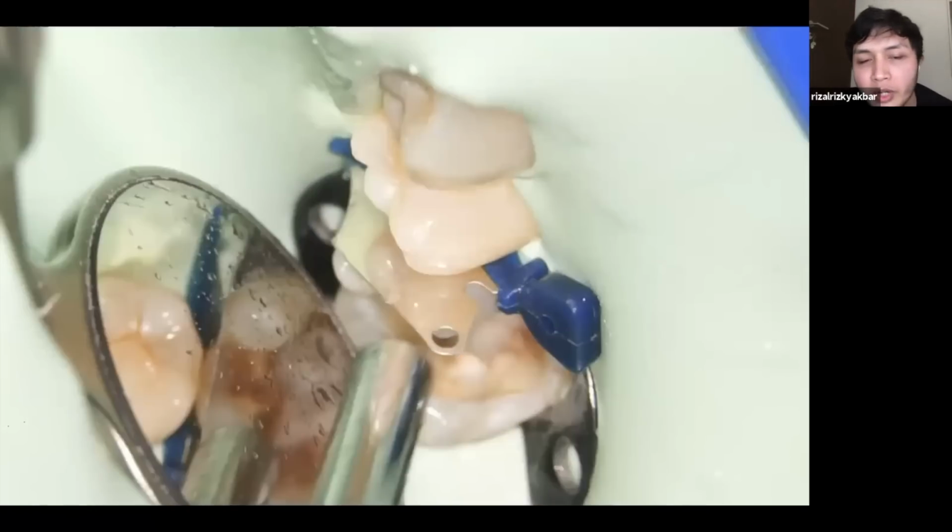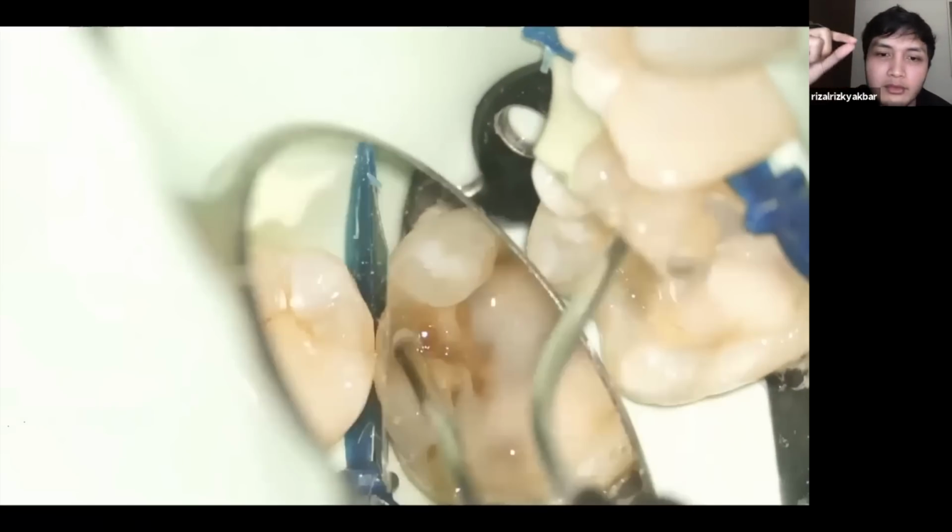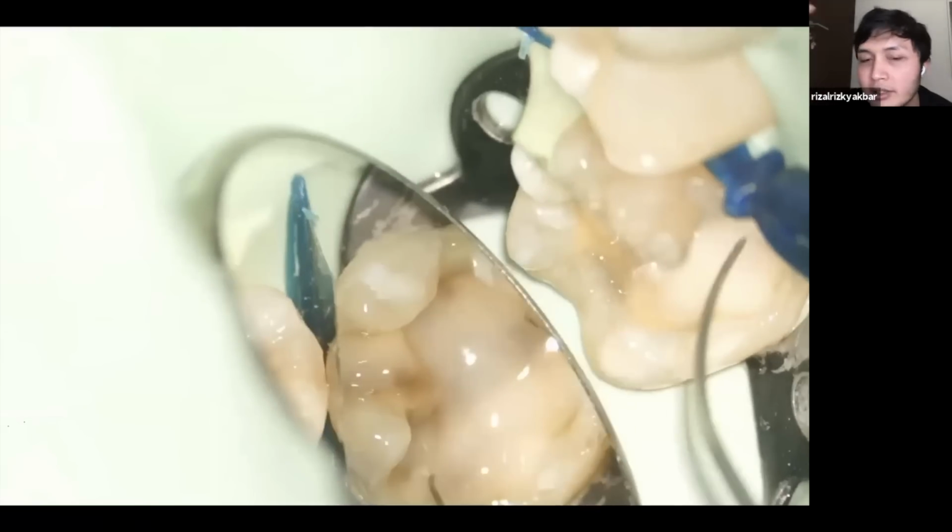If you feel bored with only using a blue or green dam, you can use a balloon dam. Yeah, big balloon, jumbo balloon. You can cut it, and then you can use that as a rubber dam. Yeah, it's very cheap.